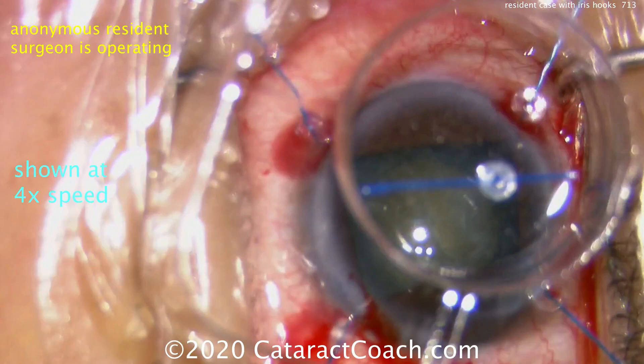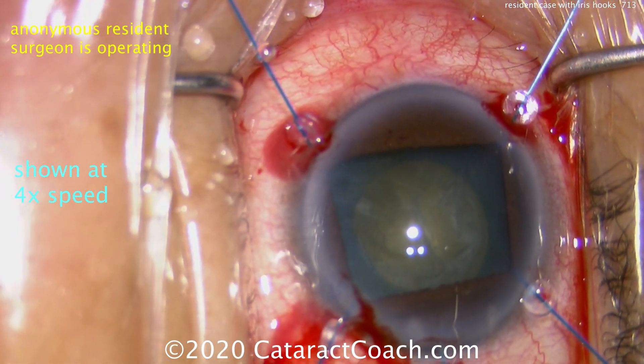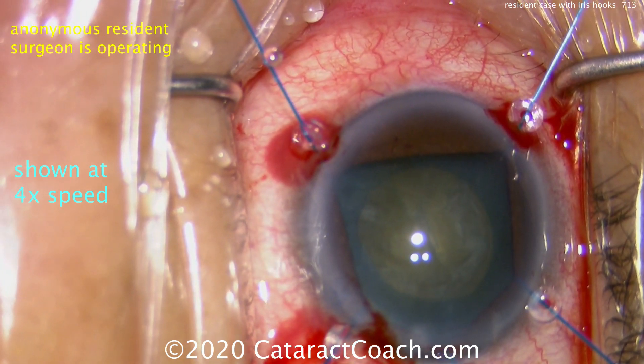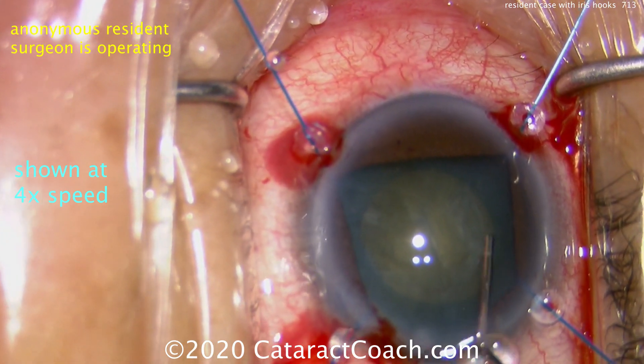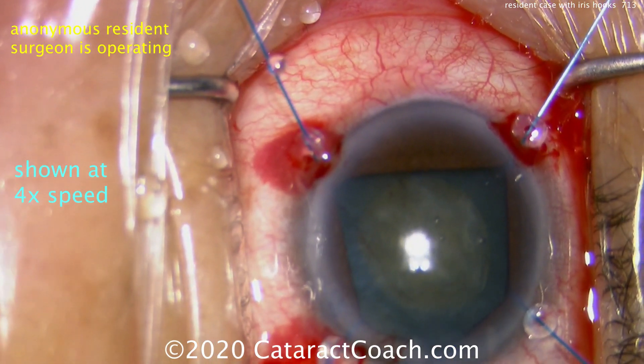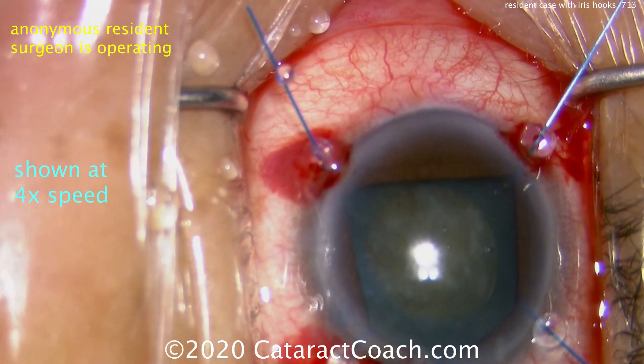It's a nice big pupil opening. There's the fifth hook, creating the pentagon shape in the sub-incisional area. That's helpful so the phaco probe doesn't get caught with the sub-incisional iris tissue.